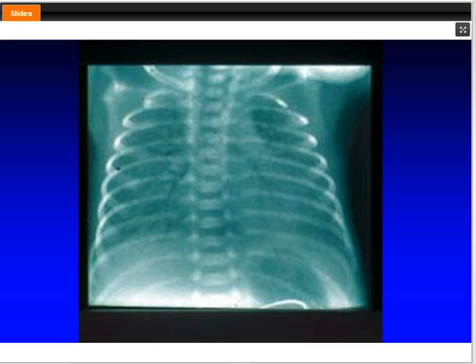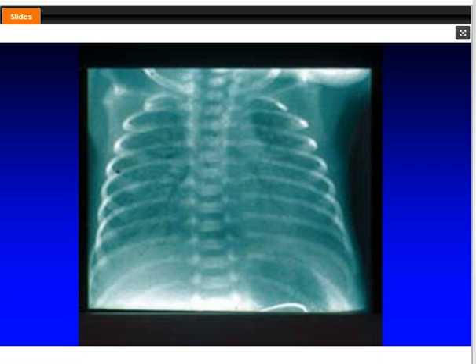Now, I think one of the keys here is you will recognize that this baby's actually 9 ribs inflated. And some people would say, oh, well, that's where you want the mean airway pressure to be. But notice the lung is white. So whether you're at 9 or 9.5 ribs, you need more mean airway pressure to get this lung inflated. So it's not just how many ribs you're at, it's what the basic lung disease looks like that becomes very critical in the management of this patient.